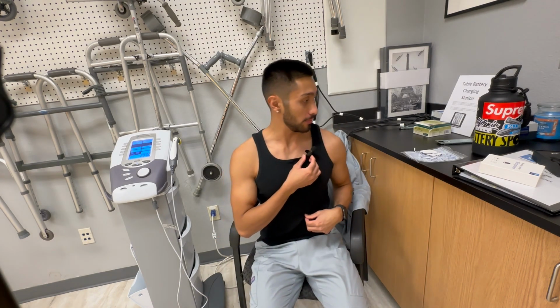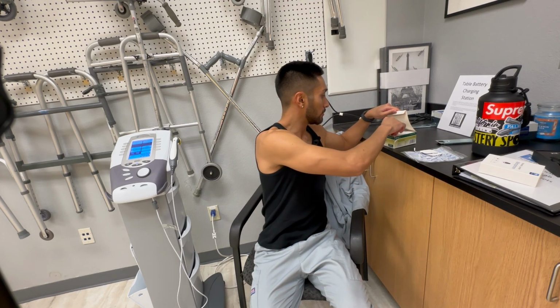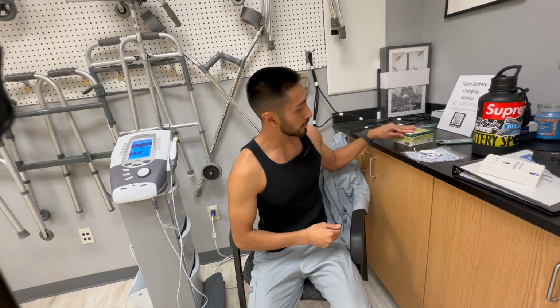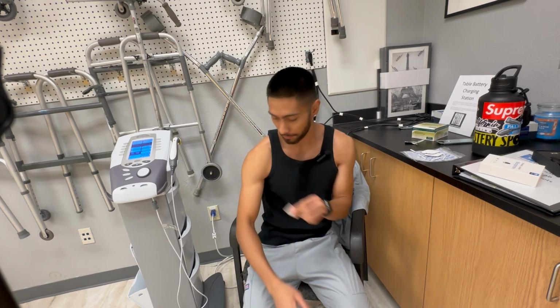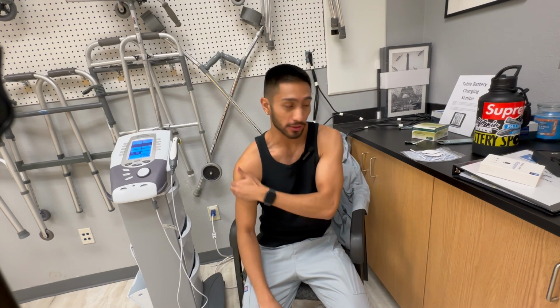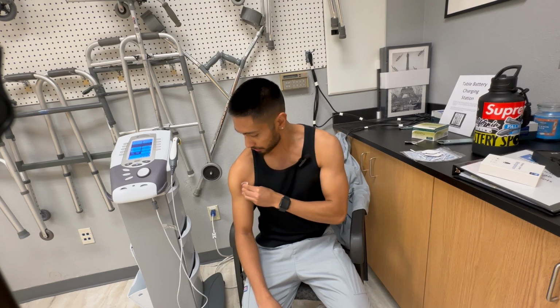So now that I have my scrub top off, I'll go ahead and get an alcohol prep pad. The alcohol prep pad is important to go ahead and clear up the area of any dirt, debris, lotion, sweat, whatever, to get the area clean for the electro pads that we're going to be placing on the skin. This allows it so it doesn't interfere with the electric currents being sent towards the region, along with it being able to stick easier. So I'm just going to wipe it down.